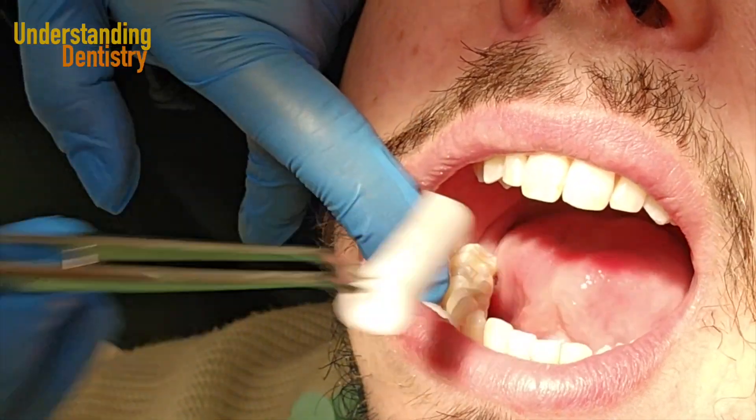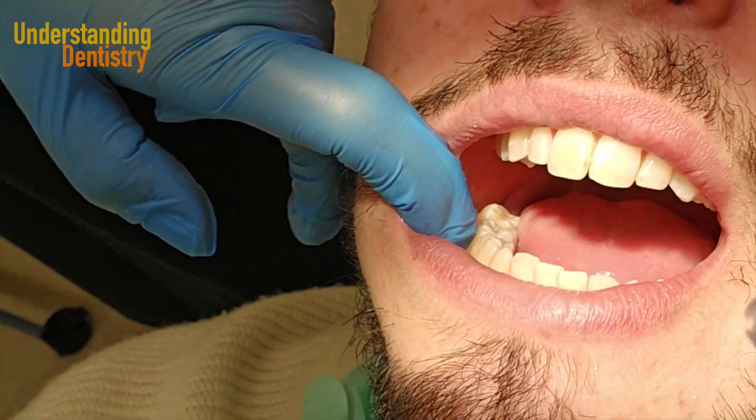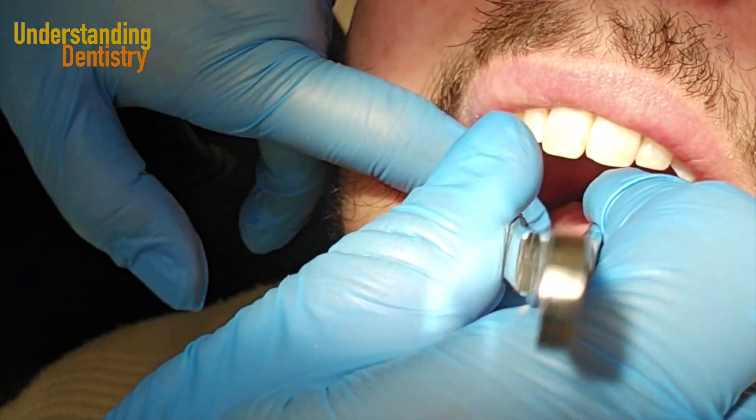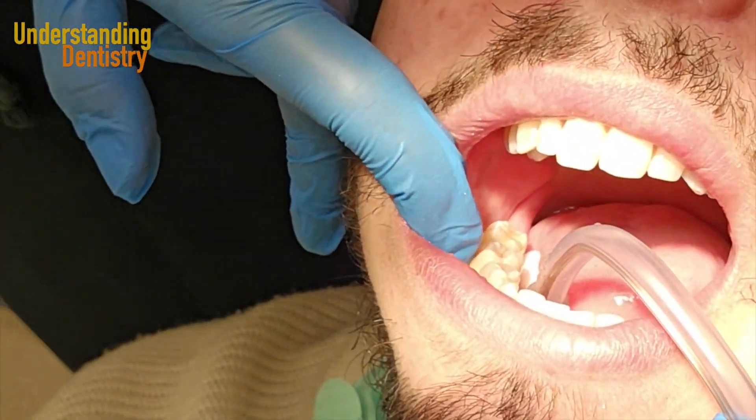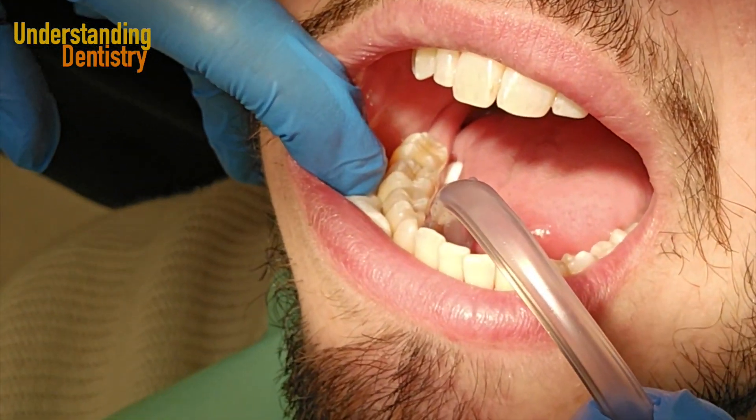Now we need to change these cotton rolls because we just washed off the etching material. Now drying the area.